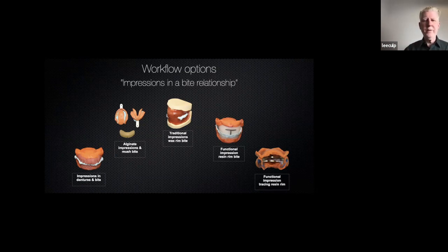And then you don't have any information at all. There's no teeth, there's no existing denture. And then you've got to come in from the beginning where a lot of dentures start. So we can do impressions and denture and bite. We can either do that digitally, or you can send the dentures in or duplicate the dentures. So let's say you've got some dentures, duplicate those dentures, put a wash impression material, take them, send them to me.